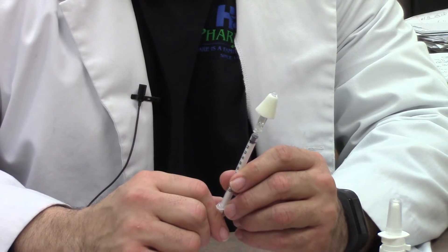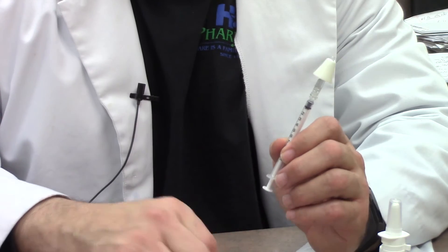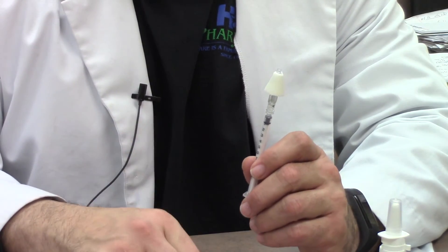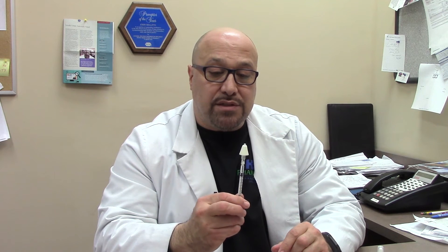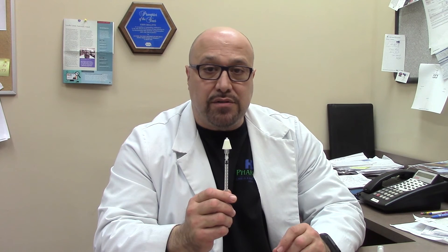If you're required to use another one for the other nostril, then you will remove a new syringe and do that for the second dose into the other nostril. Again, taking off the green cap, using the atomizer again, and then putting it into the nostril and depressing it. You see it comes out as a fine mist so that it's very easily absorbed.